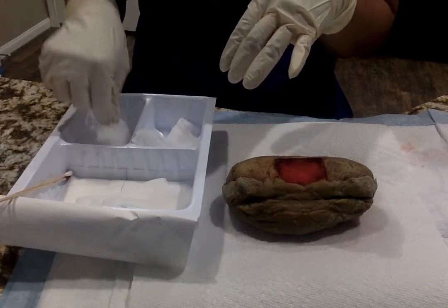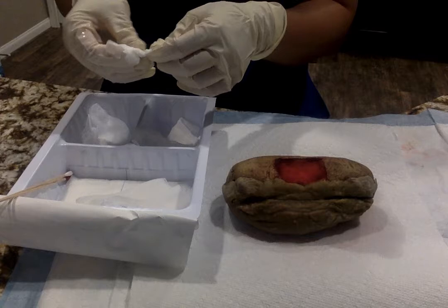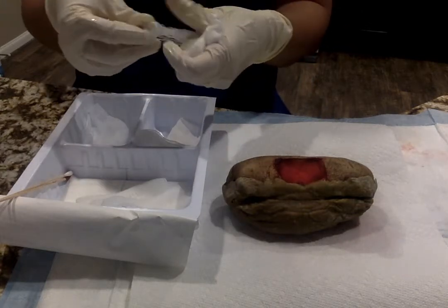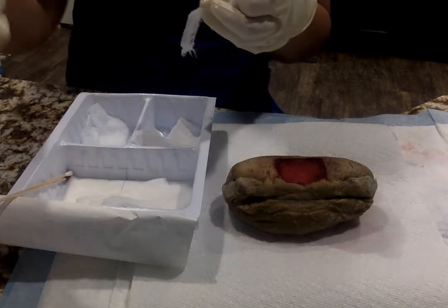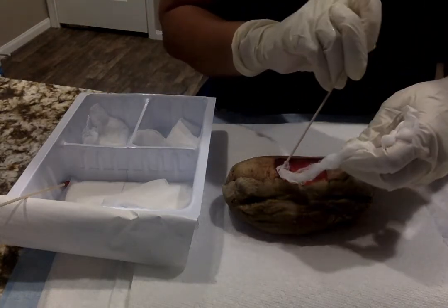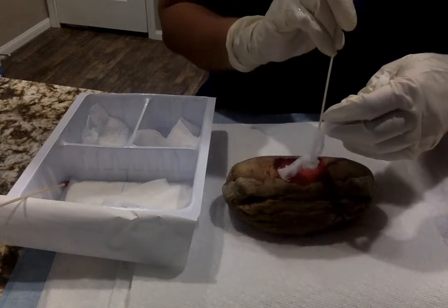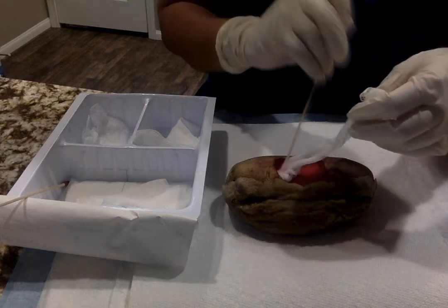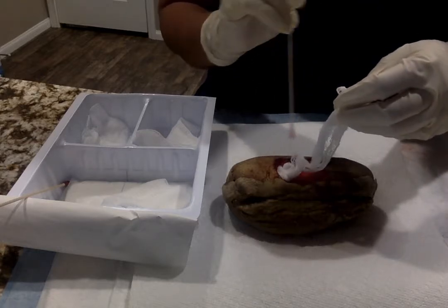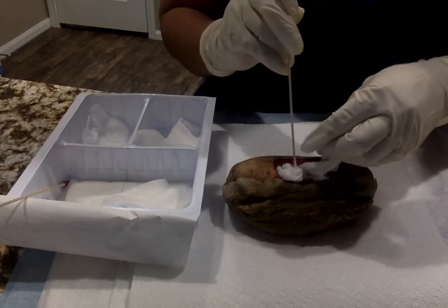I actually think I have enough. So my first one I'm going to squeeze out, and this one is going to go to my tunnel first, the tunnel at 5 o'clock. I'm going to hold it like that so I have control. I'm going to take my cotton tipped applicator and start packing the tunnel. I'm just going to gently put it in. I'm not going to shove it in there because we do want it loose. Because it was a small tunnel, I might actually cover the whole wound.